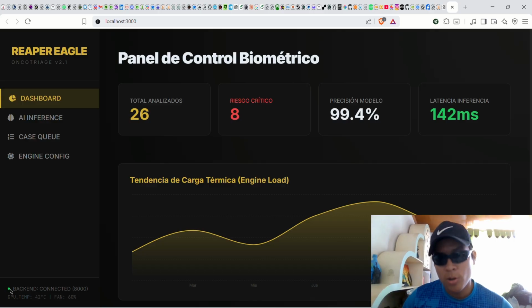There's also an important part of this software, which is latency. Latency is important, especially in the medical field, because what's the point of having a state-of-the-art engine if the latency is going to be high, that the engine is going to take like minutes to process an X-ray? So what's the point of that? So here's the latency from the efficiency marks and metrics of the model.